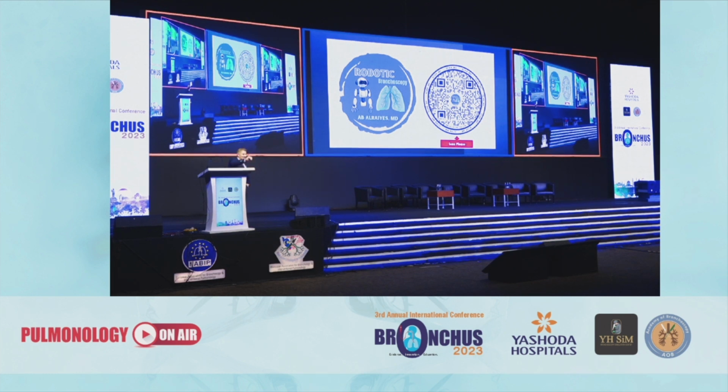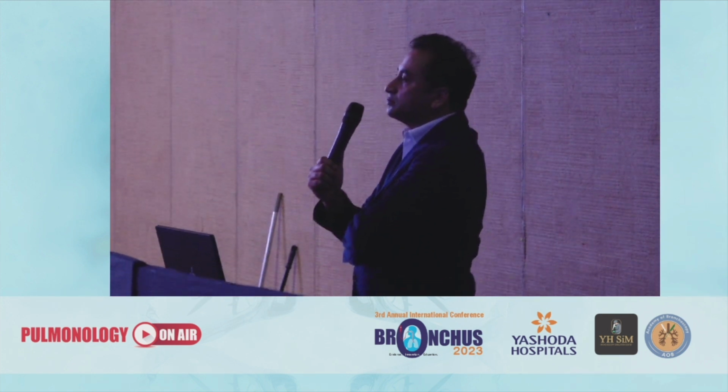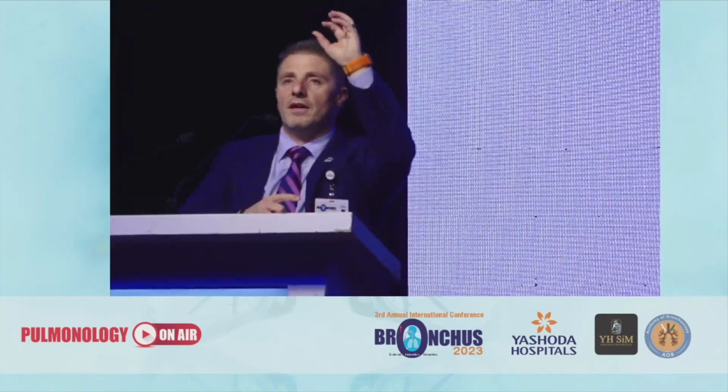So all these cases that you showed are images from the O-arm? Yes, those are O-arm images. And does the O-arm have an augmented fluoroscopy? Not augmented fluoroscopy, no. It's just the pictures that you see. Actually, it's just a spin, and then we analyze it. So we can see where the catheter is in relationship with the nodule. And when we change to sagittal, and also to coronal, then we know if we are anterior, lateral, medial or posterior, if we are apical or more caudal. All of those we analyze, and then we change the catheter.